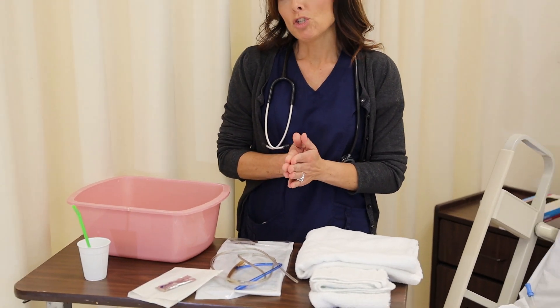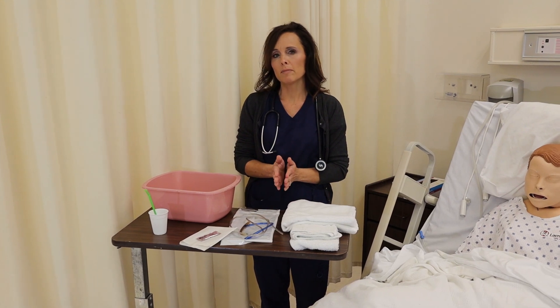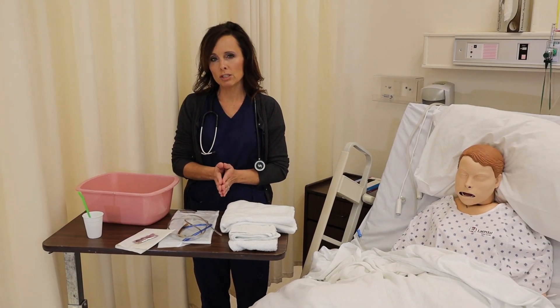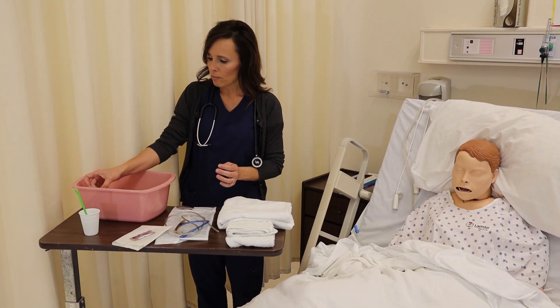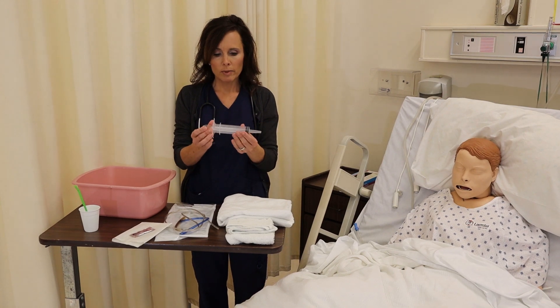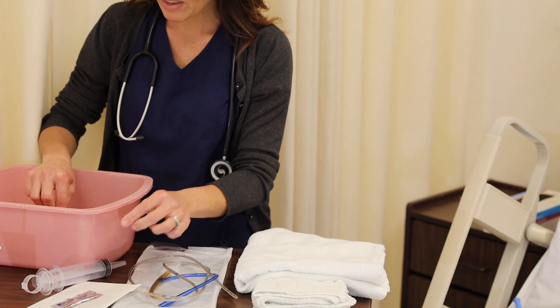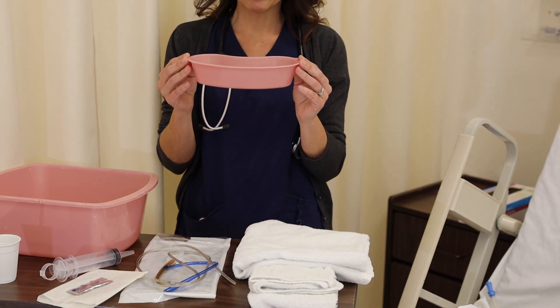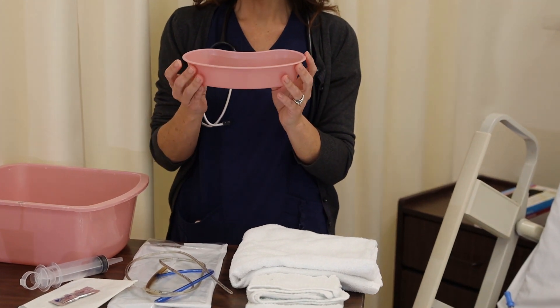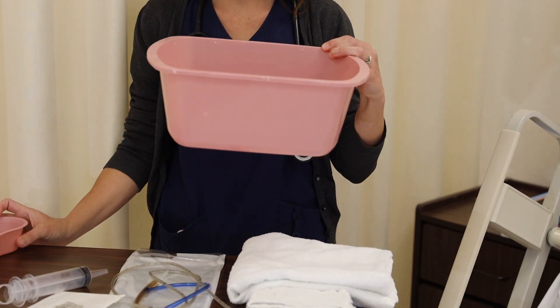Next you want the items that you will need to check placement, and we can do that various ways. We can check the pH of stomach secretions, we can instill air into the NG tube itself and listen, or you could also do an x-ray. We'll go ahead and get our syringe that we can use for getting some secretions or instilling air. If the patient vomits this probably will not be very helpful, so I would encourage you to get a large basin instead.